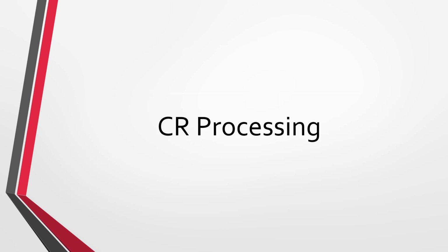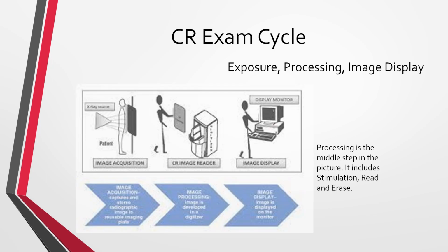We'll talk about CR processing. Let's take a look at the CR exam cycle once again. Processing is the middle step right here. There are 3 steps in the processing of the image. It includes stimulation, read, and erase.